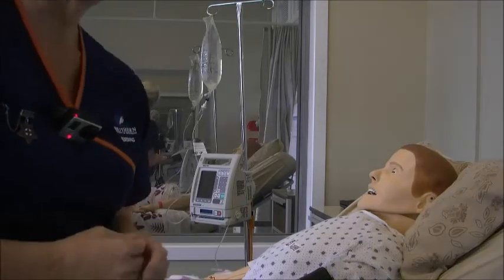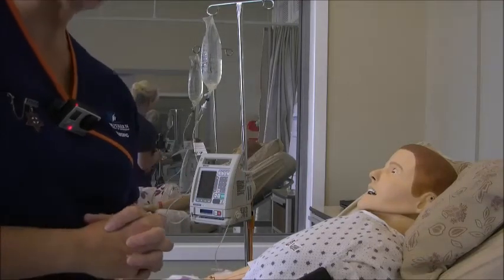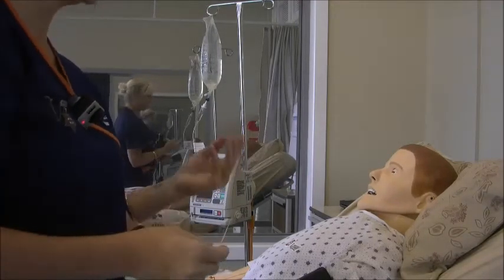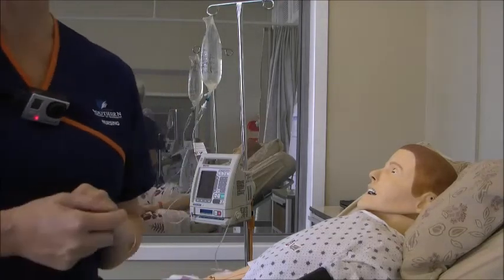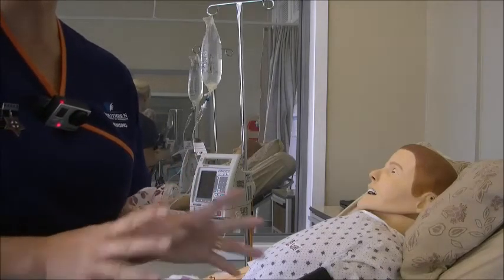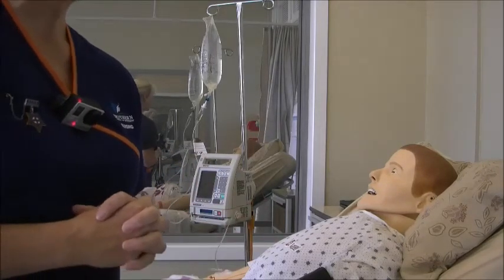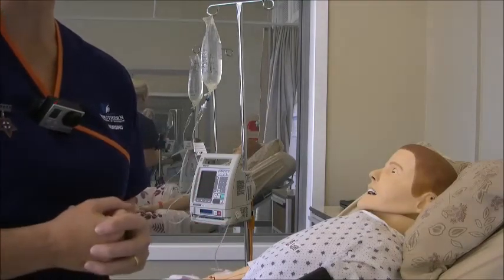Okay, the next thing I'm going to do is tidy up my equipment. So everything that I've just used that I can take away from the bed, I'm going to take back to the area over there and dispose of the rubbish. Make sure that I've washed down my trolley and stored everything that I didn't use, and make sure that I've washed my hands. So I would at that point wash my hands at the basin.